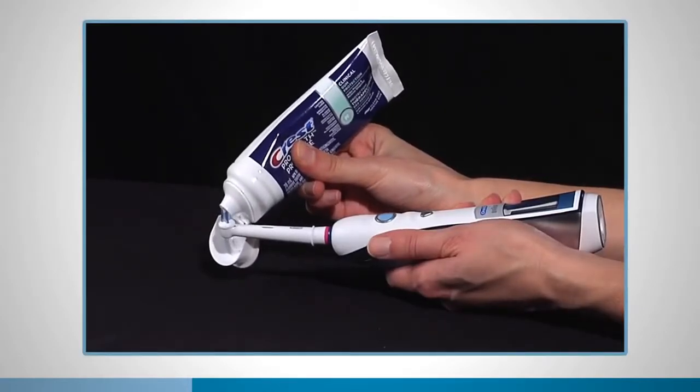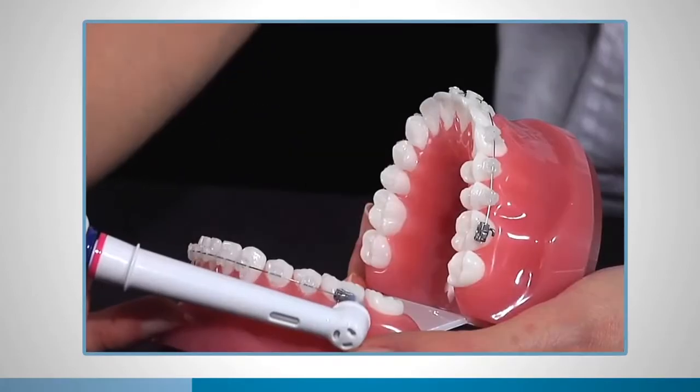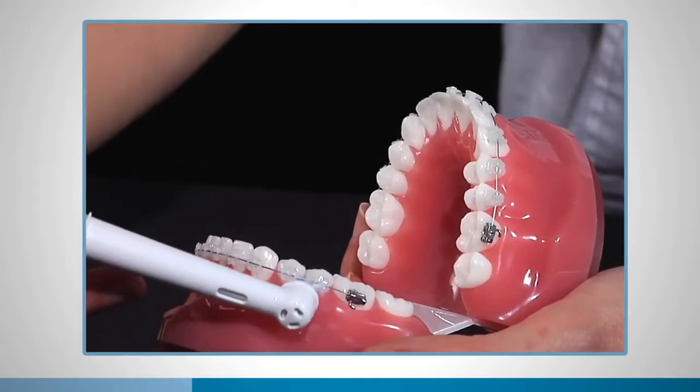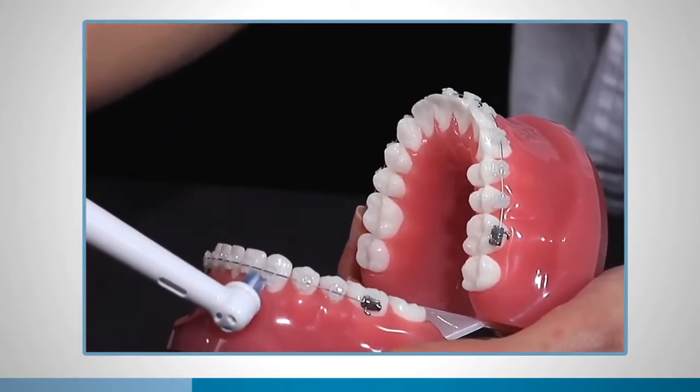Then apply a pea-sized amount of toothpaste to the bristles. Angle the bristles of the power tip toward the gum line and in between each bracket. Ensure that the power tip doesn't actually go into the gums, for this may cause gum damage. This will help you remove any debris hidden around your brackets.